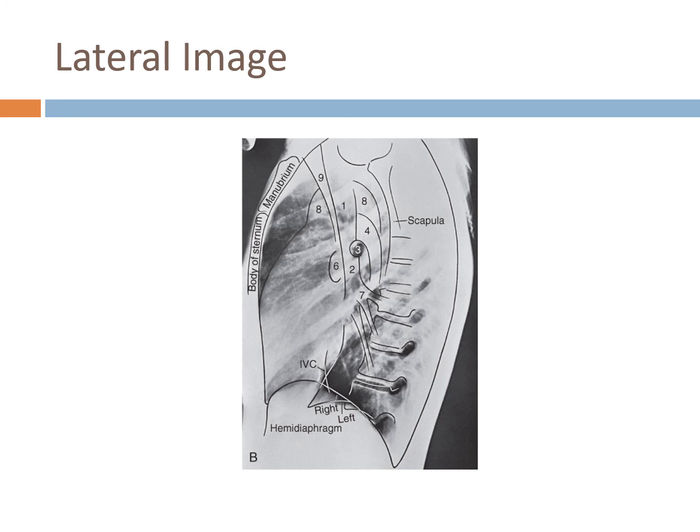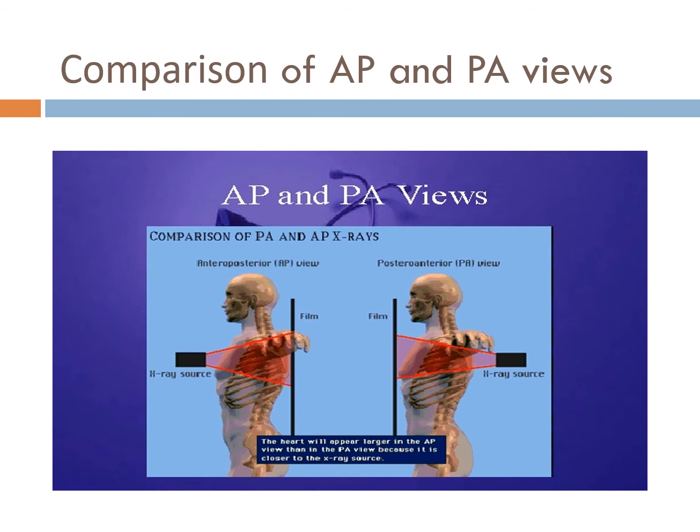So again, trying to help diagnose if there's any haziness or blunting, you want to make sure that you can see the costophrenic angles. Otherwise, you have atelectasis or possibly a pleural effusion. Generally, the presentation of the patient helps give you the clue, and then the X-ray, and then you decide whether you need to do further films or different images.